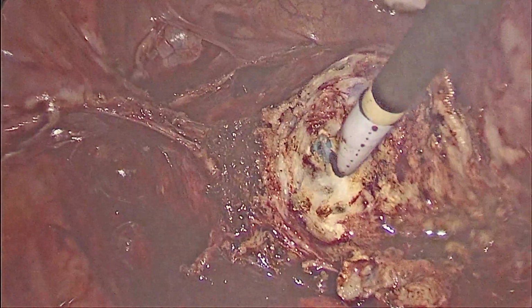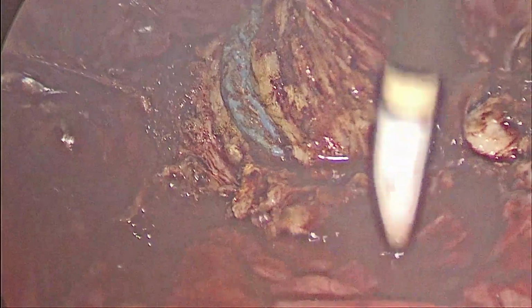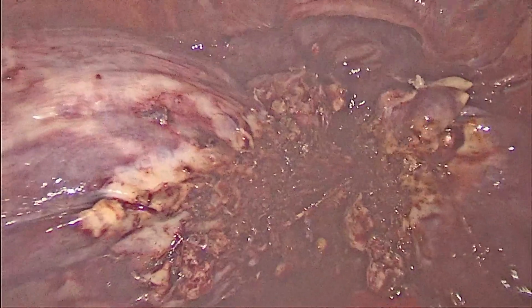Now the division of the vagina on the left side is completed using unipolar. As the dissection was complete, we can very well use the unipolar energy also.